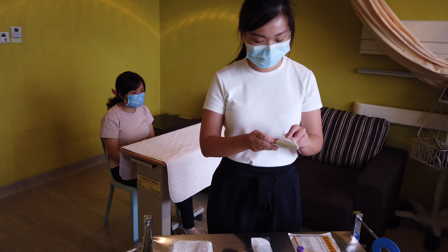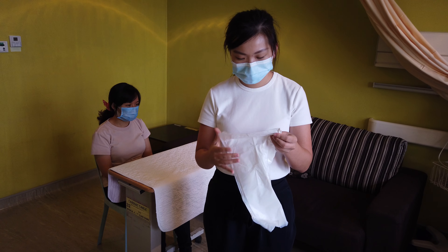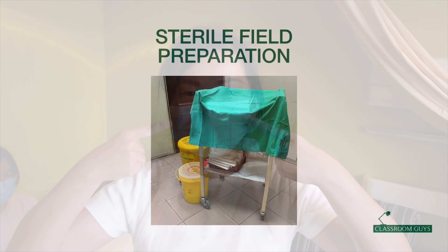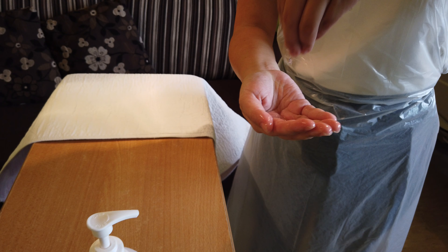You may now put on your personal protective equipment. Your PPE includes a sterile apron and surgical mask. To prepare your sterile field, first wash your hands with alcohol rub using the WHO's 7-step hand hygiene technique.